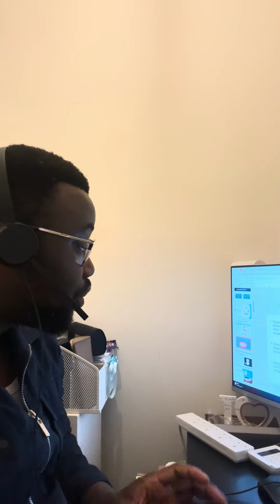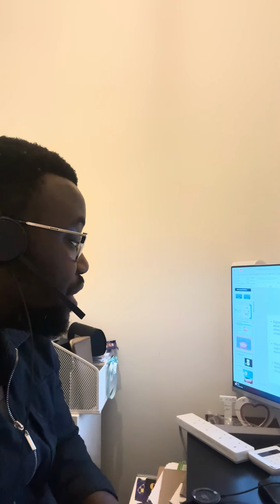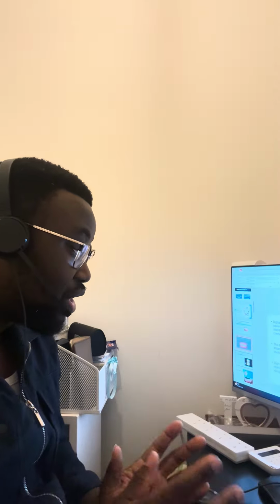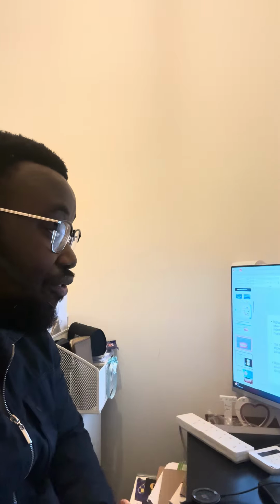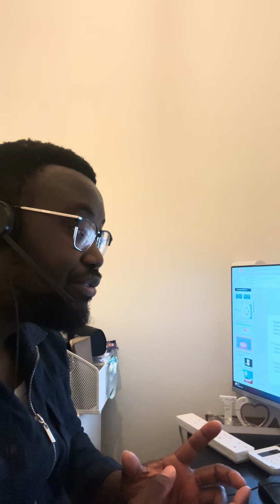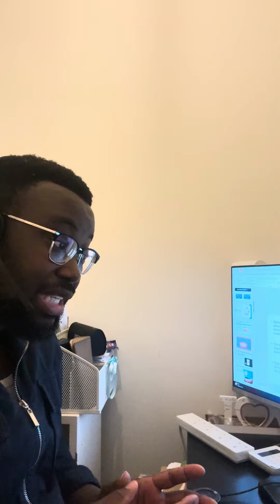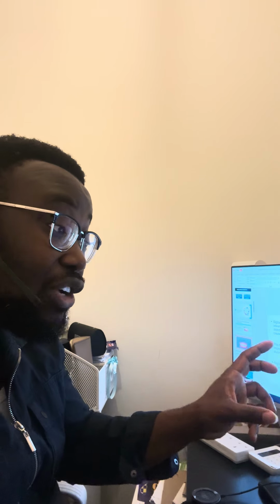And we say that digital dentures also provide the opportunity for dentists to easily store and replicate denture designs for future replacement. So this is one other advantage of incorporating the CAD/CAM system in your denture workflow. This gives you the opportunity to store that in a patient's file electronically.